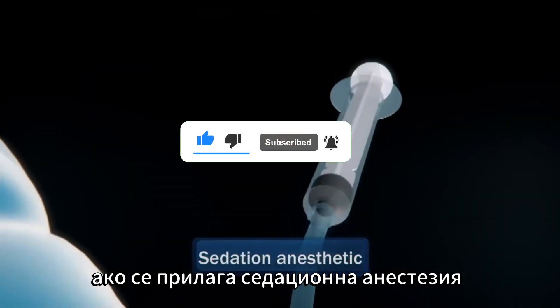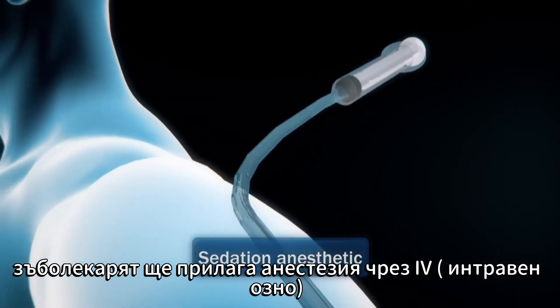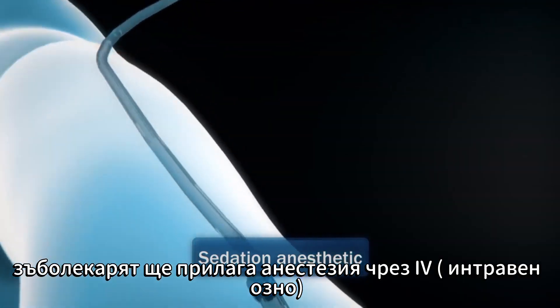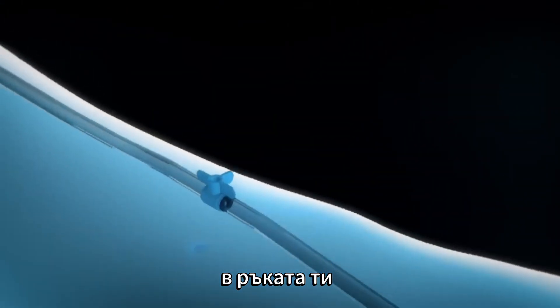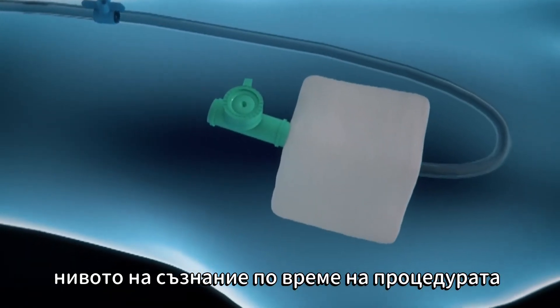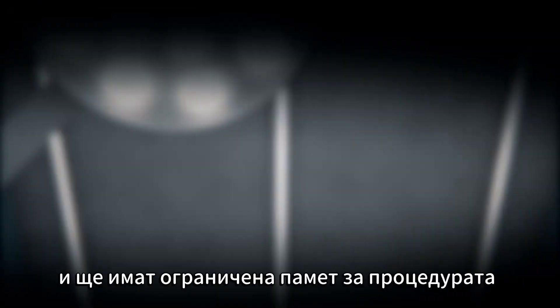If sedation anesthetic is applied, the dentist will administer anesthesia through an IV into the arm. Sedation inhibits the level of consciousness during the procedure, so the patient will not feel any pain and will have limited memory of the procedure.